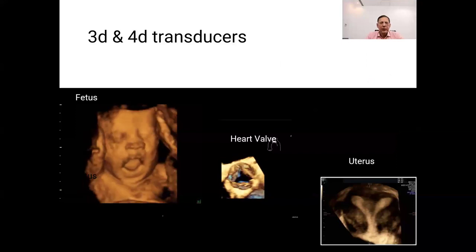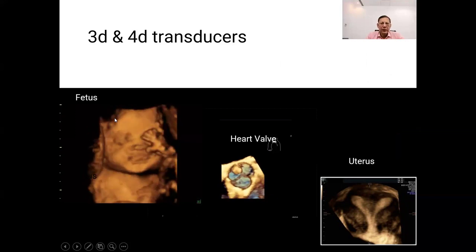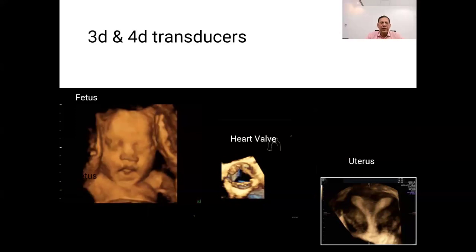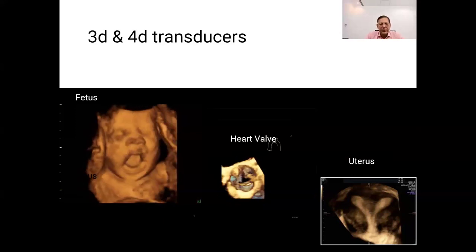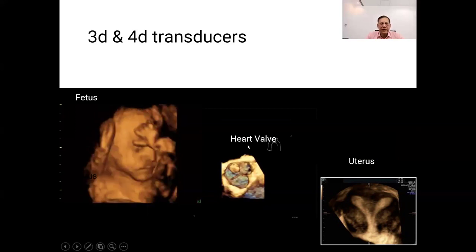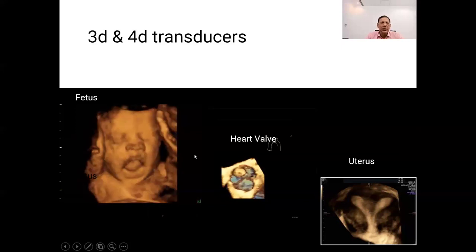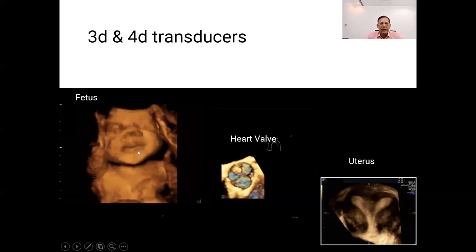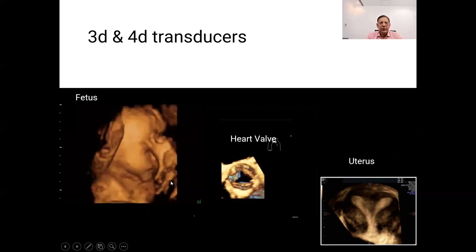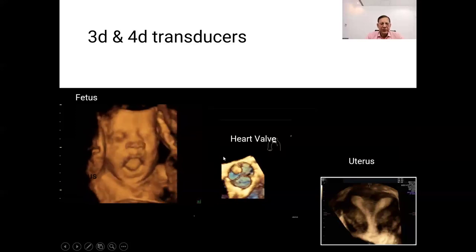Image construction: the collected data from two-dimensional images taken at different angles is combined and processed by the ultrasound machine to reconstruct a 3D image, which provides a more comprehensive view of the anatomy compared to traditional 2D images. Their main application is obstetrics, widely used to obtain detailed images of the fetus during pregnancy, allowing for better visualization of fetal development and detecting abnormalities.